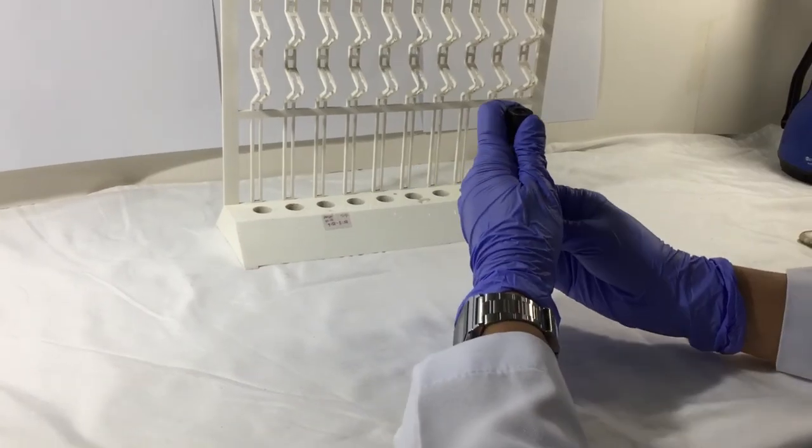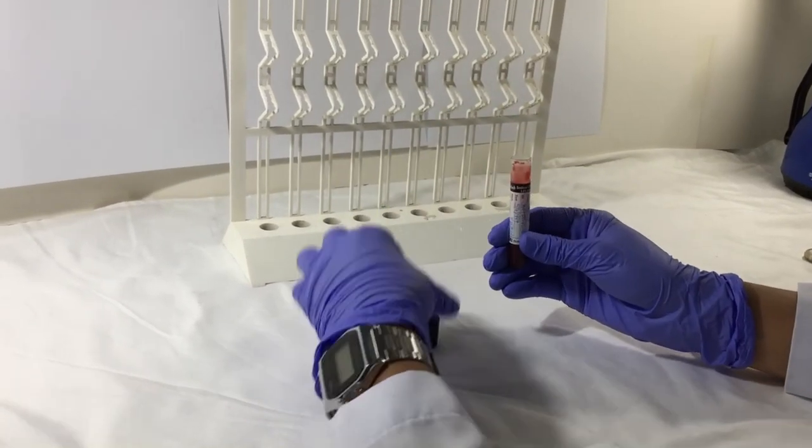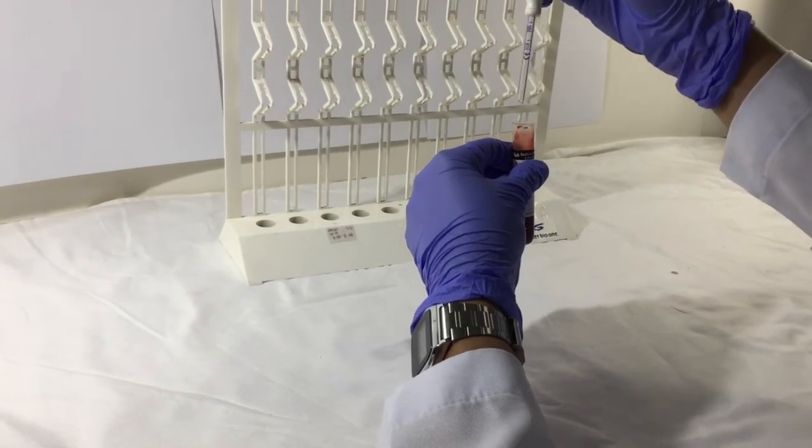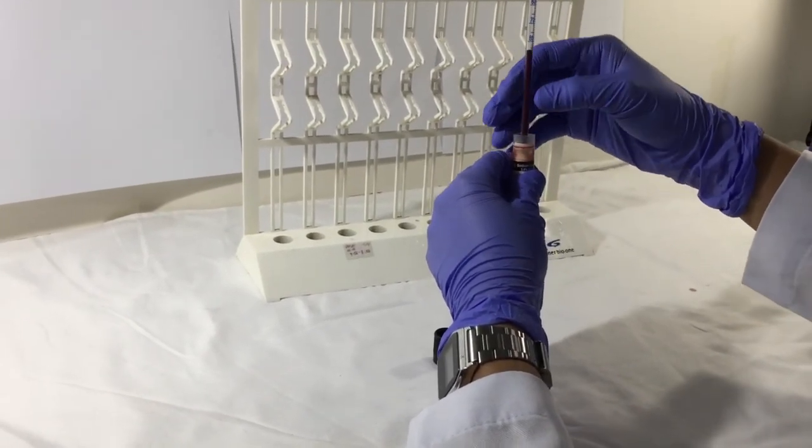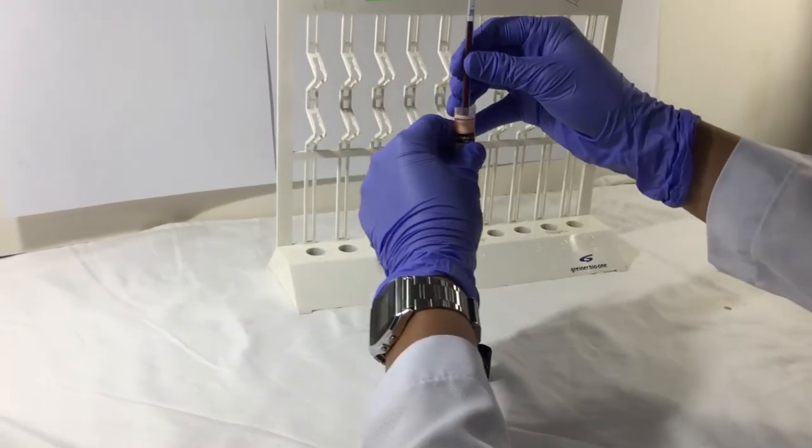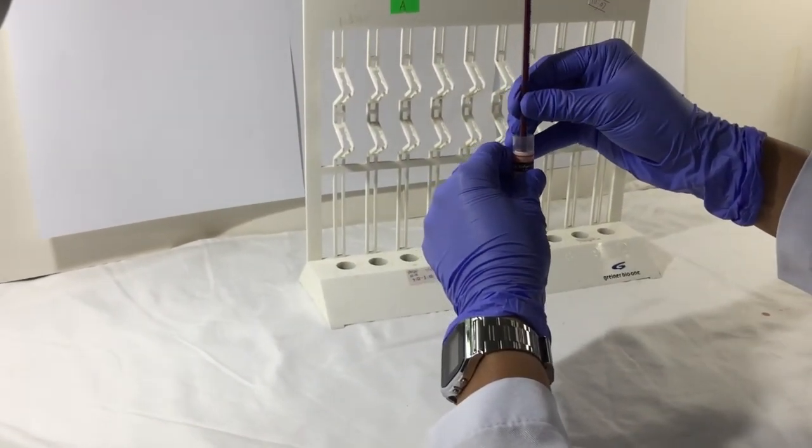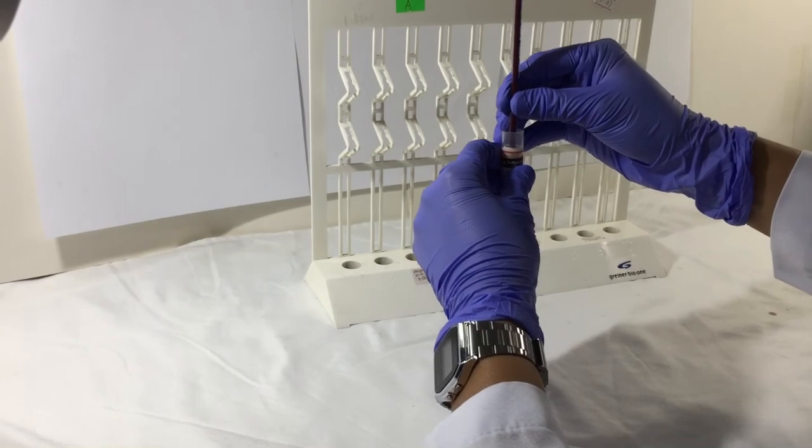Next, remove the cap of the vacutainer tube. And then, place the Westergren tube into the vacutainer tube and wait until the blood reaches the zero mark. Make sure that air bubbles are not present inside the Westergren tube.